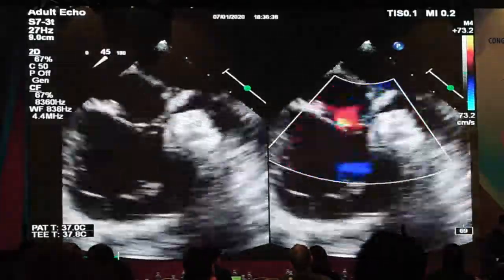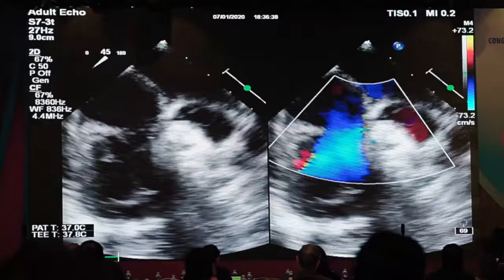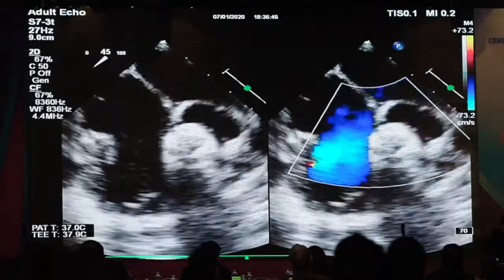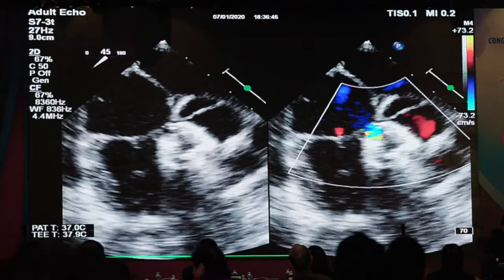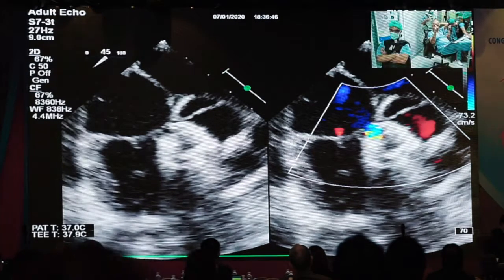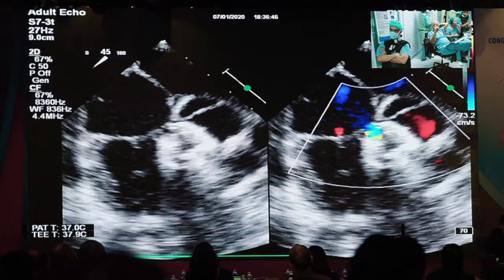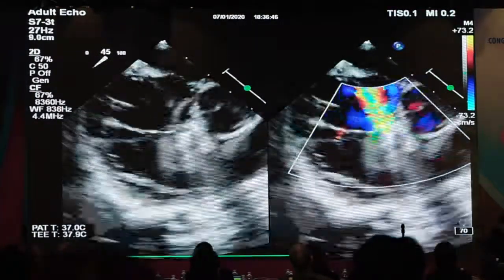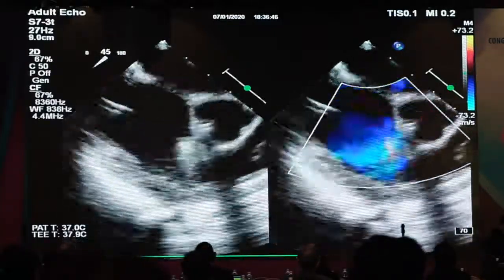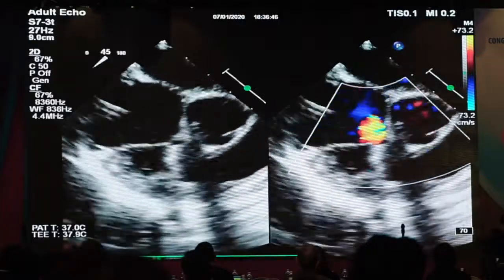It's always a pleasure to be in the lab here with Warren and the rest of the team. This is an interesting VSD, isn't it? It's perimembranous, obviously. On the transesophageal echo, there are some views where it extends into the inlet with very little inlet rim. On other views, it looks smaller, so the shape of the defect is not circular, it's more elliptical. The difficulty arises about the sizing of the defect, and it's not one particular modality that you determine the size with. It's not just the angiogram and it's not just the echo pictures.